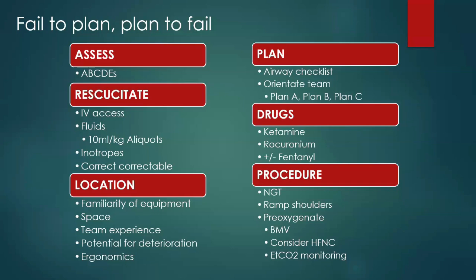Right next door to this, they talk about location. So a lot of it speaks to the ergonomics of the situation. If you are comfortable and your team is comfortable and the team is well experienced and you're doing this in the right place at the right time, your success rate is going to increase. So it's all about your familiarity of your equipment. Know what space you're working in, where you would do this. You do not want to be looking for things whilst you're doing this procedure. You want to be familiar with where it is and how to get hold of it.